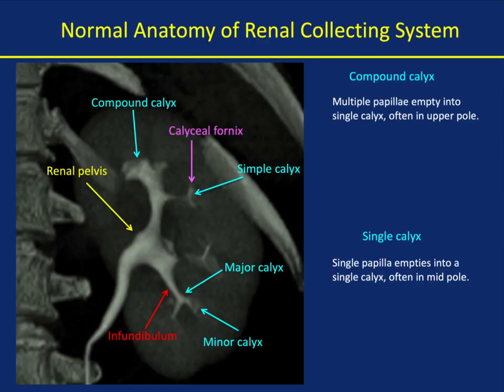If you look at a normal collecting system, you can see the infundibulum, the renal pelvis, a simple calyx, and a compound calyx. A single calyx is when a single papilla empties into a single calyx, often in the mid-pole. With a compound calyx, multiple papilla empty into a single calyx, often in the upper pole, which you can see very nicely here.